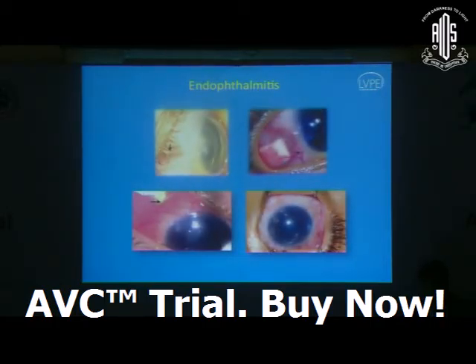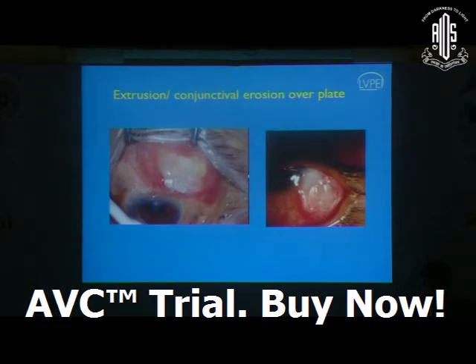If you have it, then we'll have to explant it, because you also know that some of the bugs are sitting in the tube, so we can't leave it there and do a vitrectomy and continue with antibiotics. If you see something like that, it's better to explant the tube. You don't have to remove the plate, but the tube has to come out of the eye.